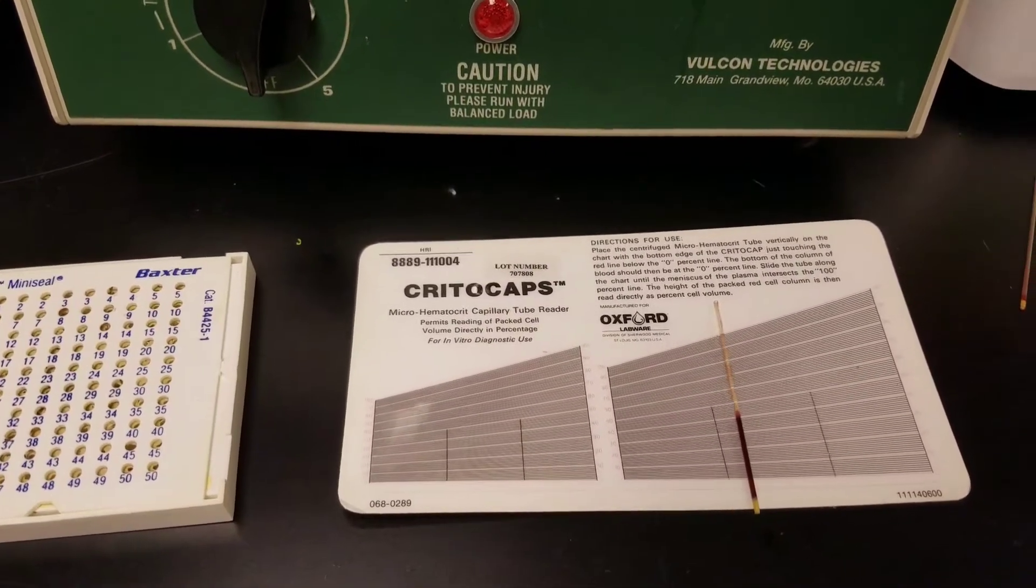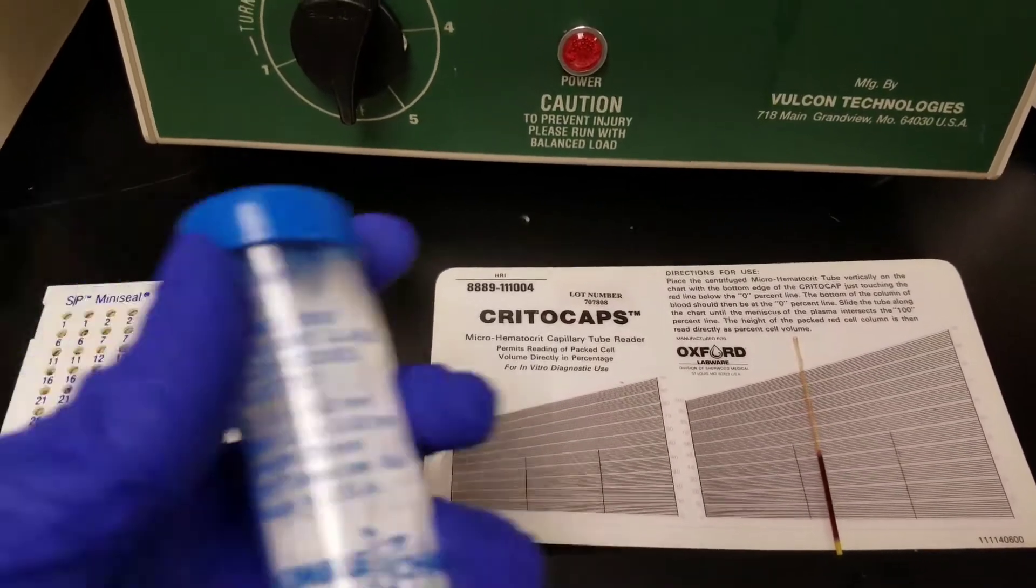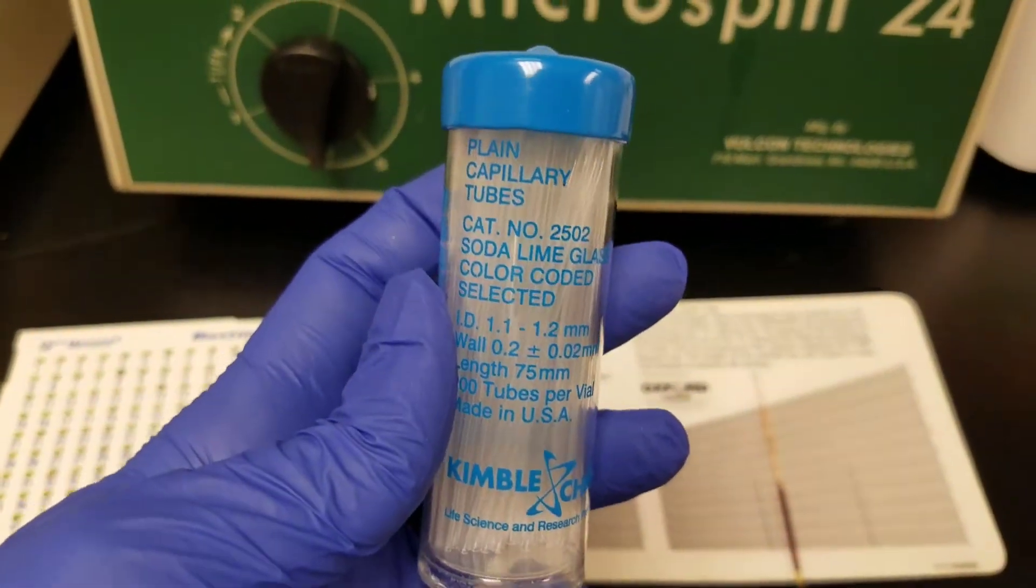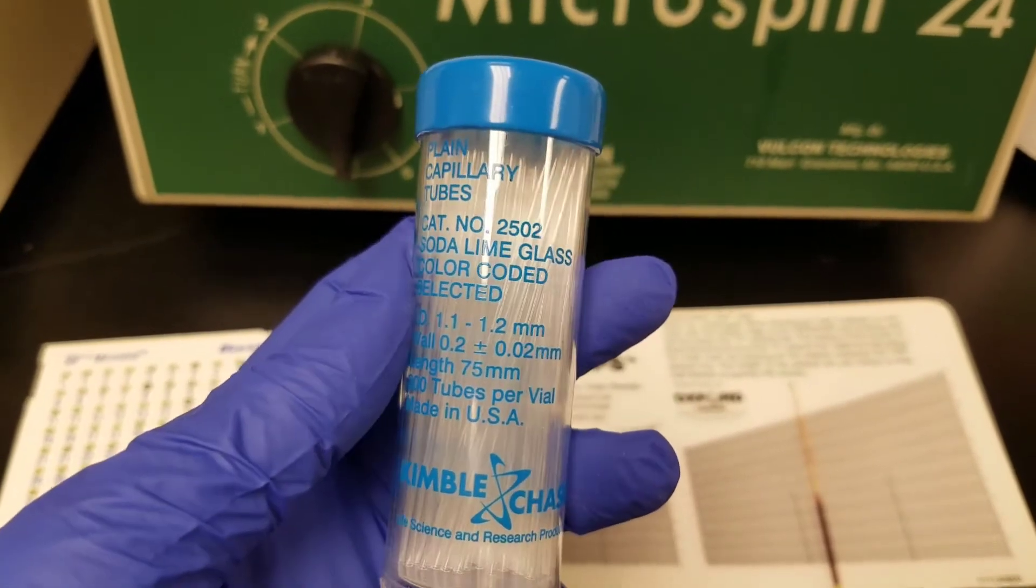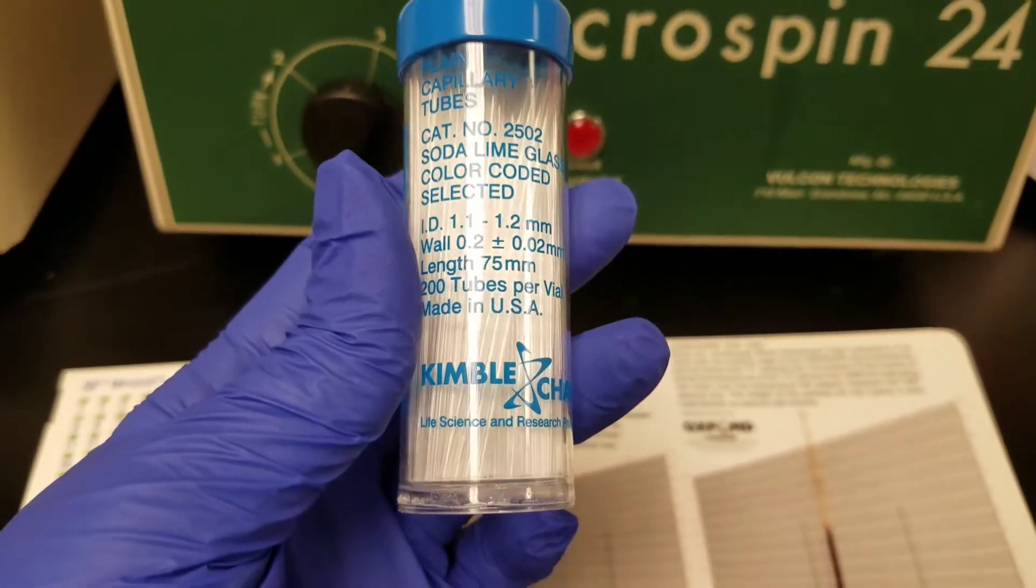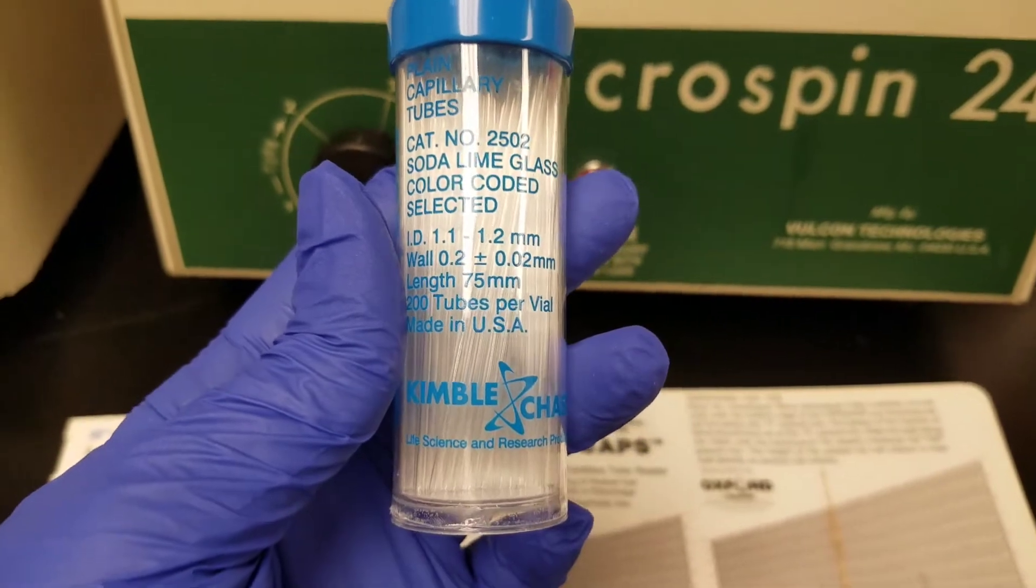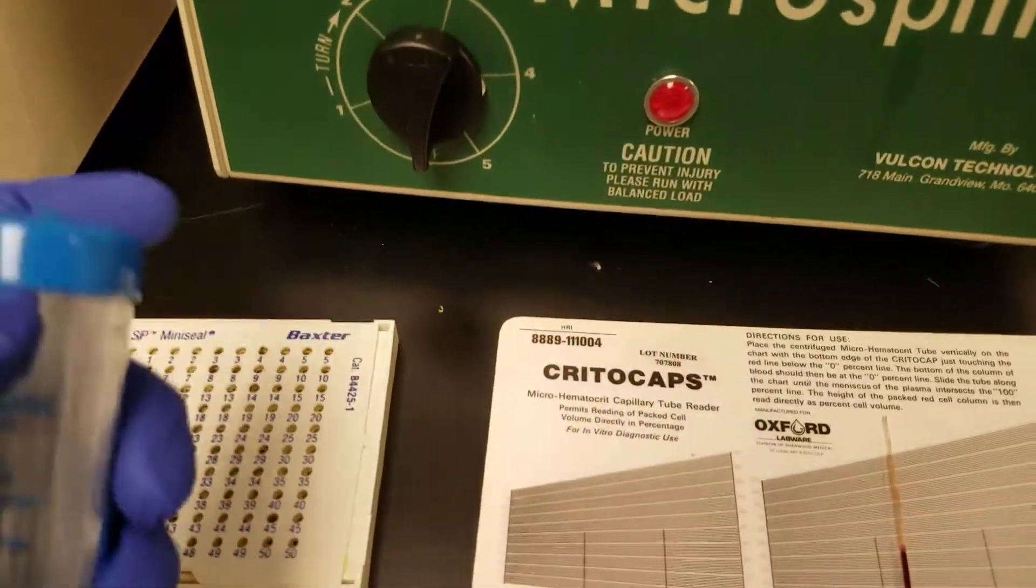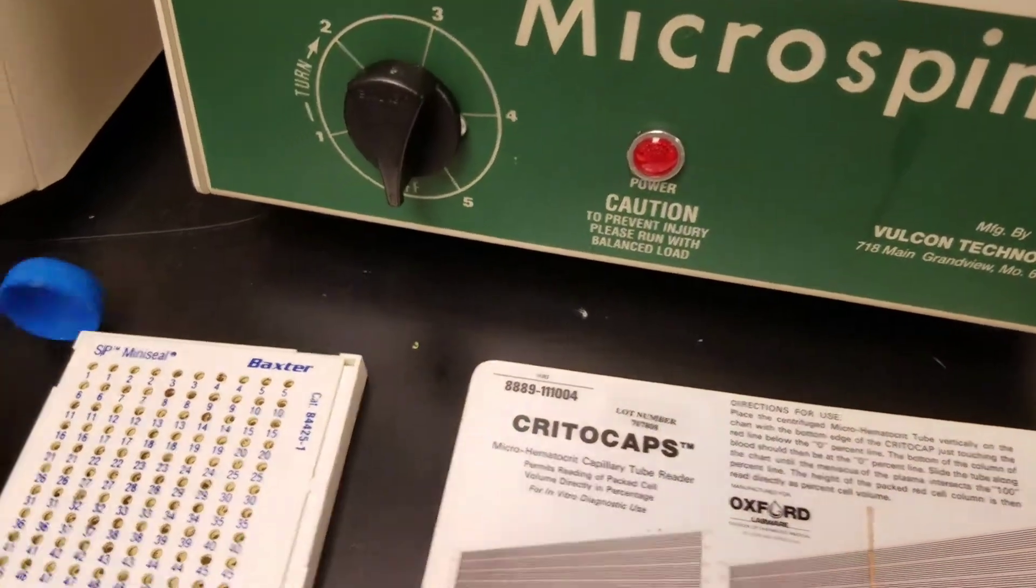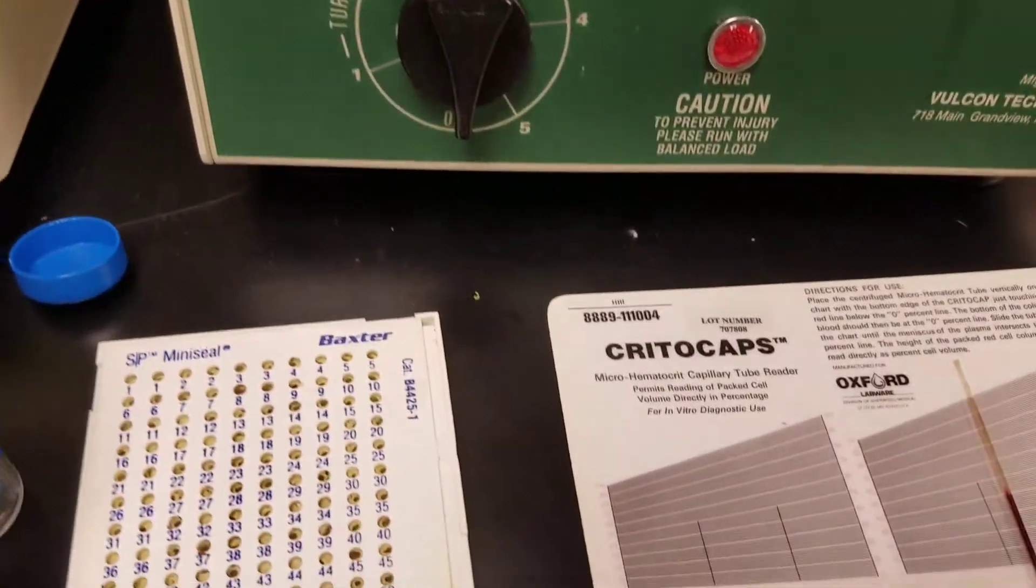What you will need are some glass tubes. These are just plain capillary tubes - soda lime glass, color code selected. These are 75mm in length. Now these are really pretty thin so they can be broken. Like I said, they are glass.